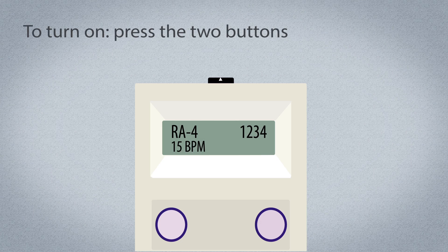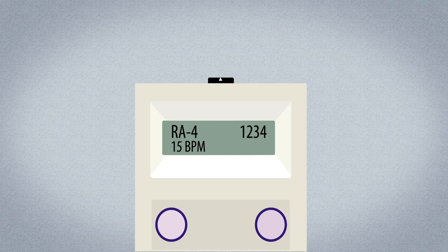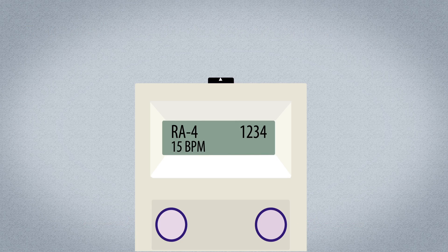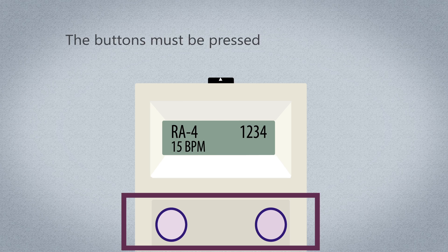To turn the Nurex EPG on, press and release the two buttons on the front of the Nurex EPG at the same time. To turn the Nurex EPG off, press and release the two buttons on the front of the Nurex EPG at the same time. The buttons must be pressed at the same time — this is a safety feature to guard against accidentally turning the EPG on or off.